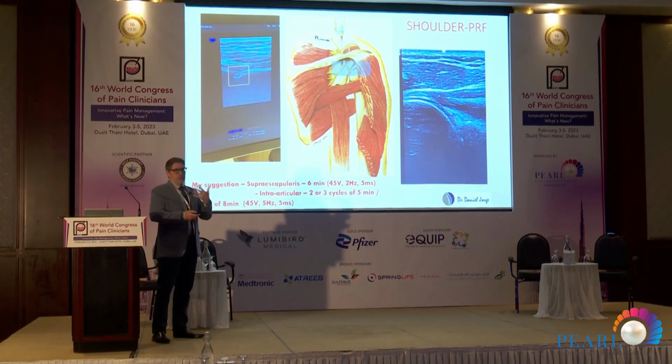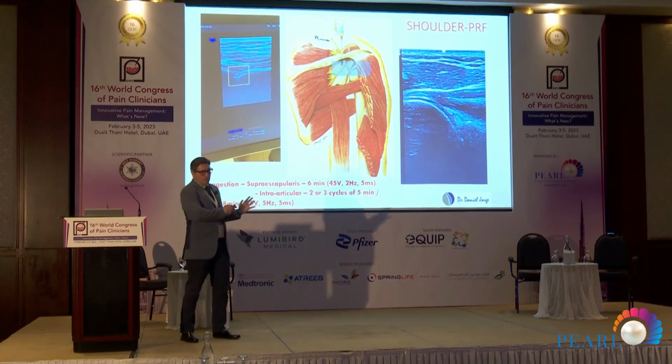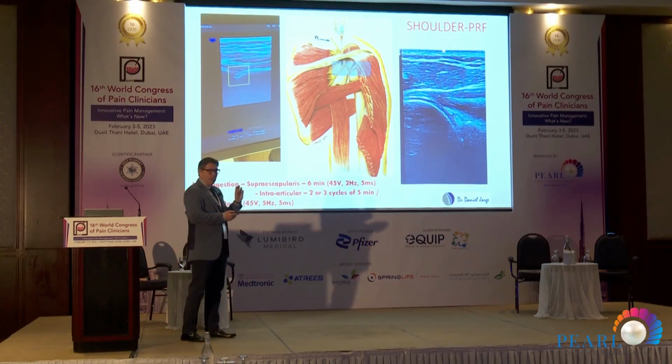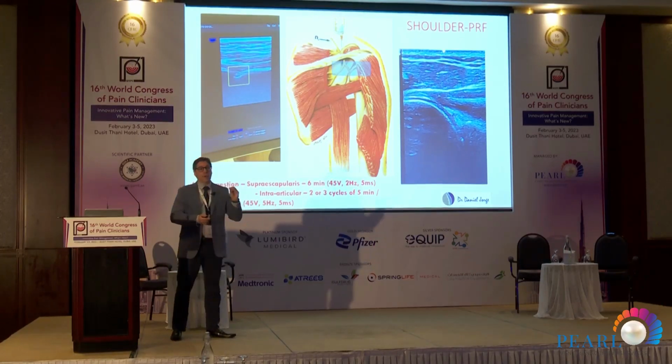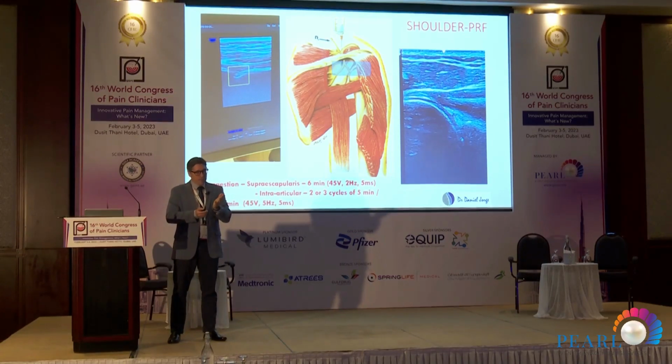You can, as usual, use your ultrasound up here, but for those who are starting to use the ultrasound in this kind of procedure, I suggest a little trick, because actually you can go at the dorsal position of the scapula, and you will have the exit of the suprascapular nerve there.